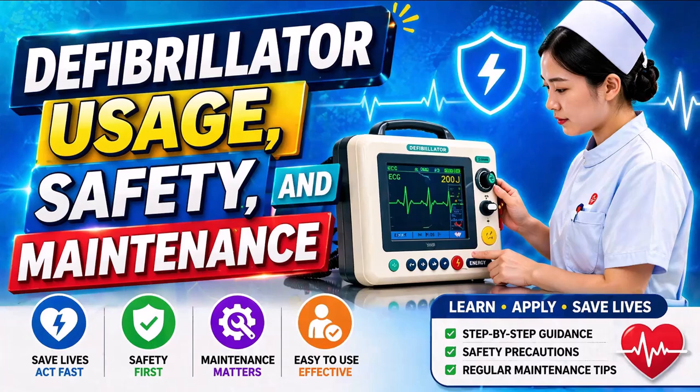Safety is a critical aspect of defibrillator usage. Before delivering a shock, operators must ensure that no one is touching the patient or the bed. This is why verbal warnings such as "clear" are used. Failure to follow safety procedures may result in accidental electrical shock to healthcare providers.